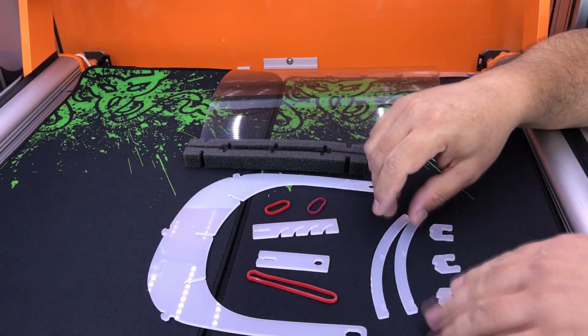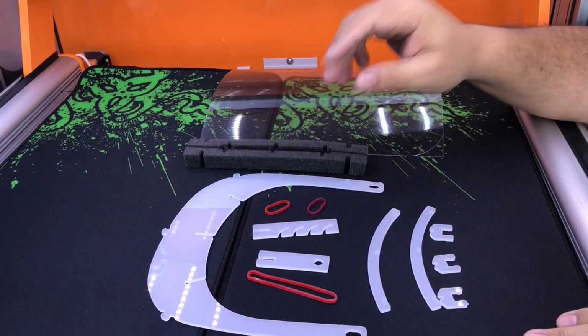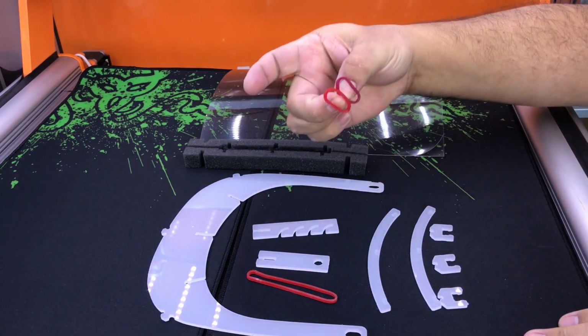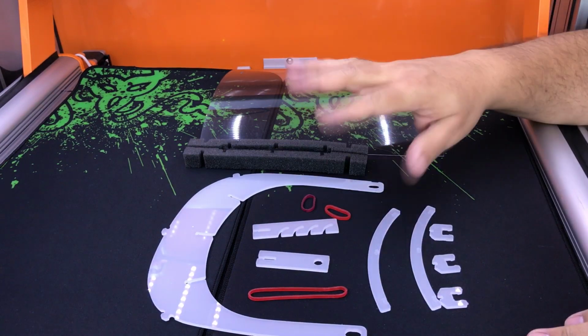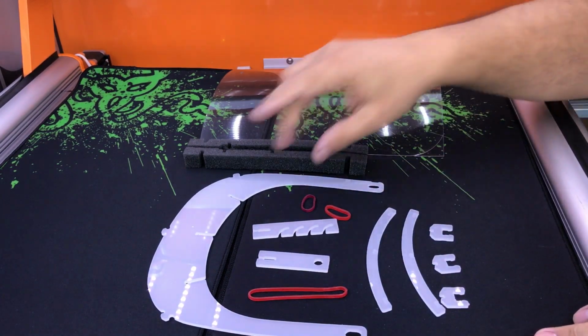I want to show you how to assemble the face mask. This is the part that you need, that you make with the machine. Besides the part, you need two small rubber bands and a little larger rubber band to hold some of the parts. And it's very simple.